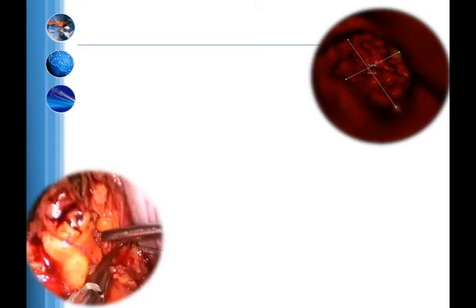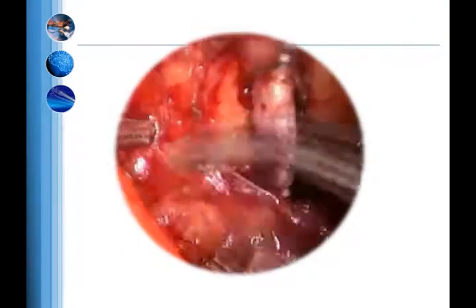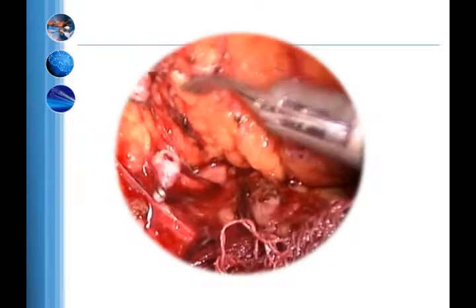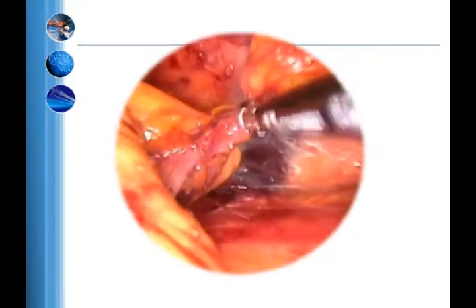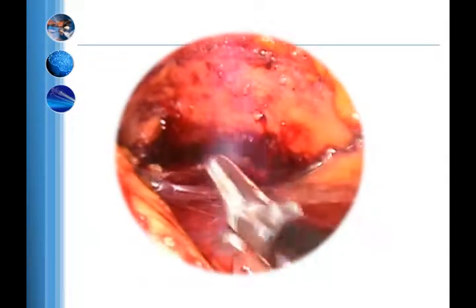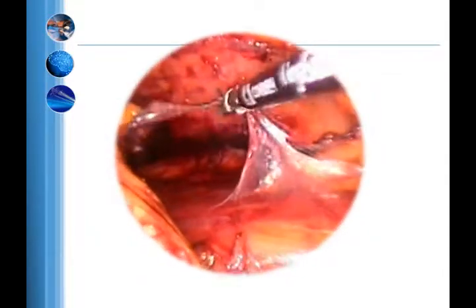Treatment plan executed implied laparoscopic ureteronephrectomy and laser resection of the orifice. You can see the state of the kidney removed in the video.